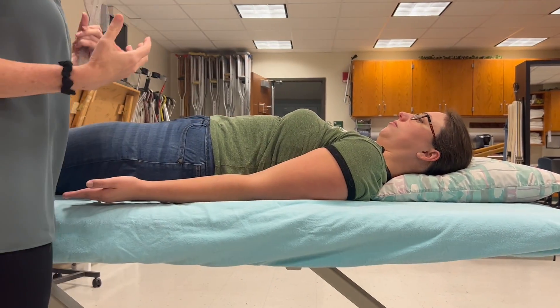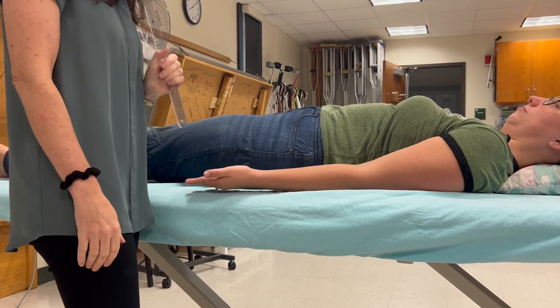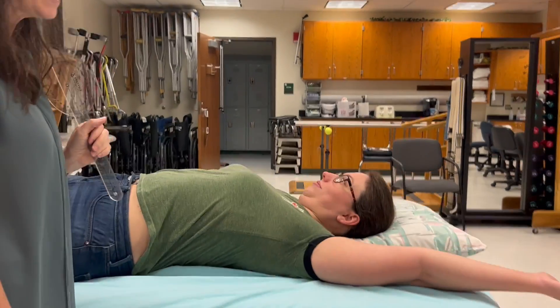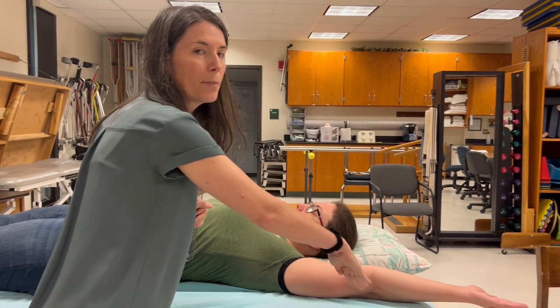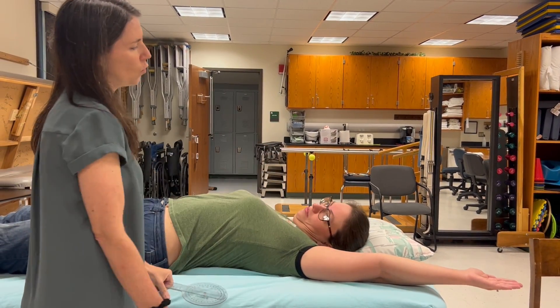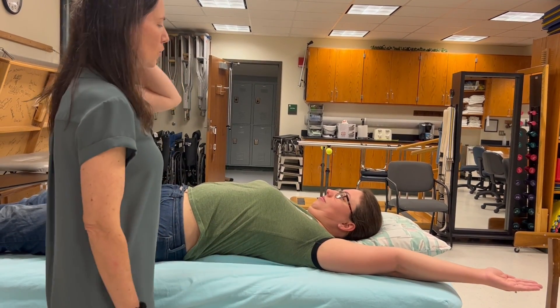Typically I would stand here — just make sure you're not standing so close that when she abducts, she accidentally touches your body. A common compensation we see is someone who lifts off of the table and doesn't keep that motion in the pure frontal plane. Another compensation is side bending the neck toward the shoulder and potentially side bending the trunk away, although that's harder to do when you're supine.